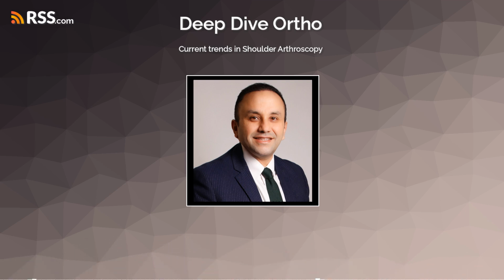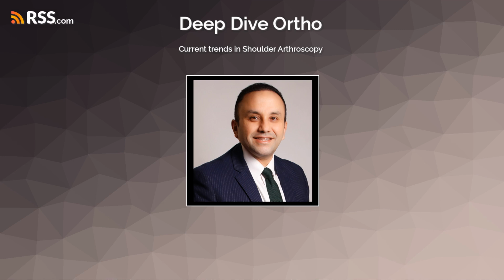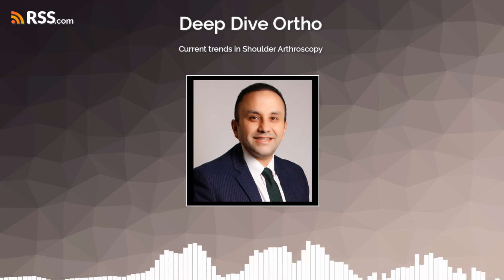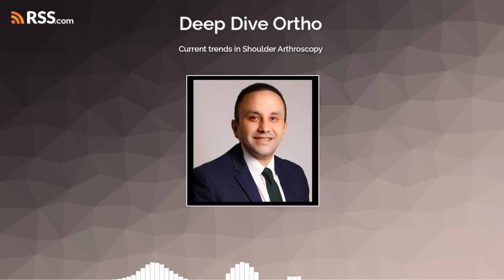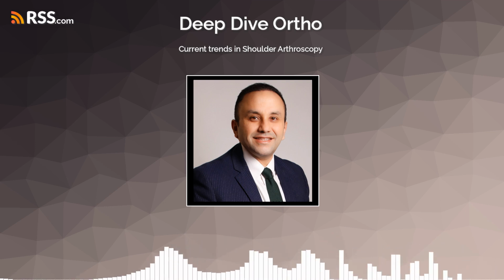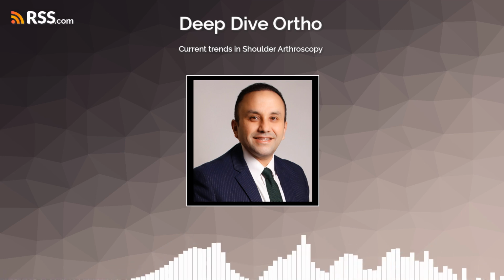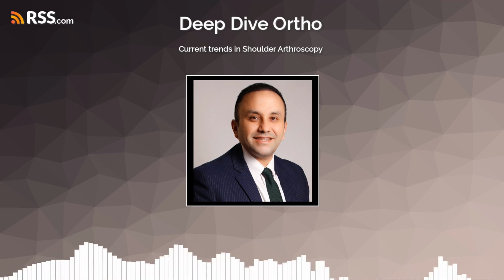What does cleaning up involve? It can include removing loose fragments of cartilage, smoothing out rough surfaces on the cartilage or bone spurs, maybe releasing a tight capsule, and addressing any associated soft tissue issues like biceps tendon problems or small rotator cuff tears. The goal? The goal is primarily to relieve pain and improve function, maybe delaying the need for a joint replacement. But it's important to realize it's not a long-term fix for the underlying arthritis itself. It's more palliative.